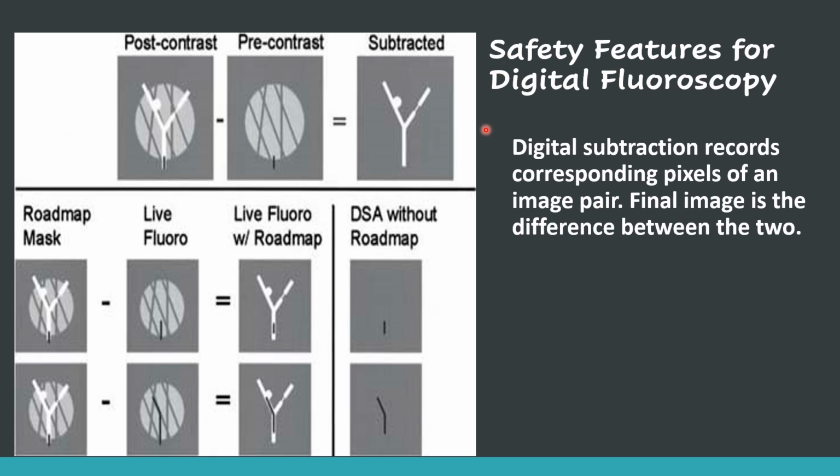Safety features in digital fluoroscopy. Most of this, again, should have been covered in Mr. Dawes' class as well as Ms. Francis's. Here we have digital subtraction records corresponding pixels of an image pair. Final image is the difference between the two.